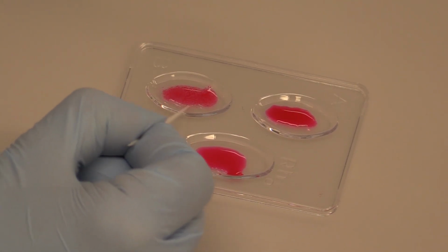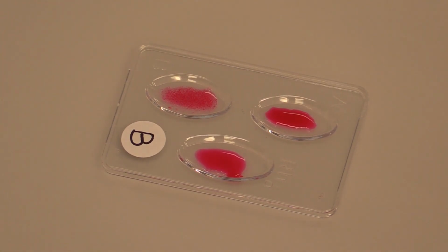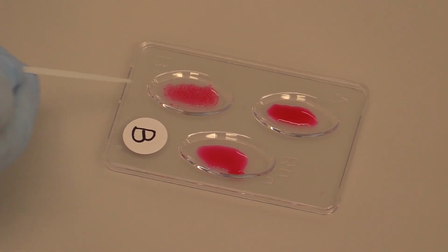Okay, so the reaction is fairly quick. It can take a bit longer than about a minute or so. And we can already start to see, I'm not sure if the camera's catching this, the clumps forming in B.